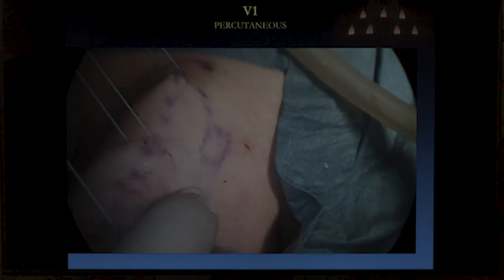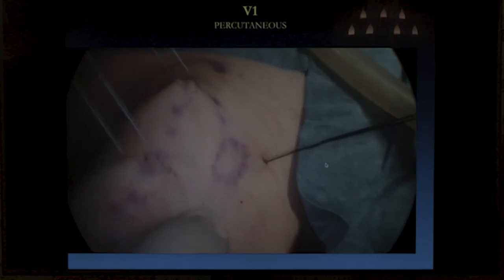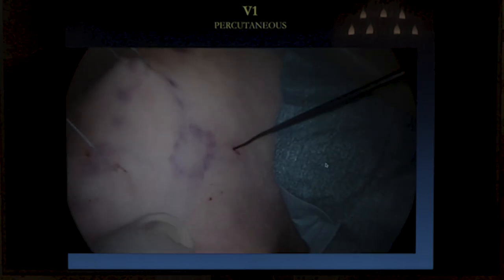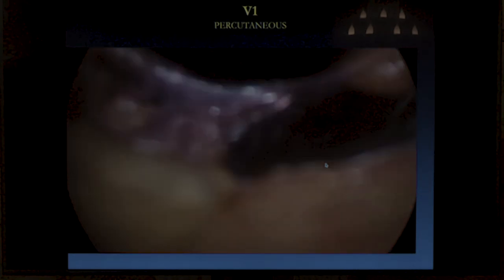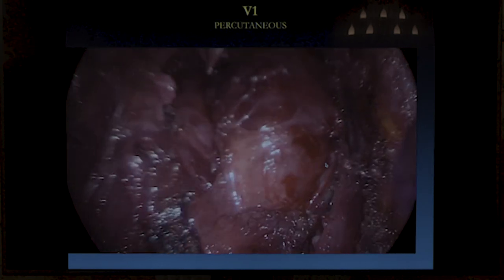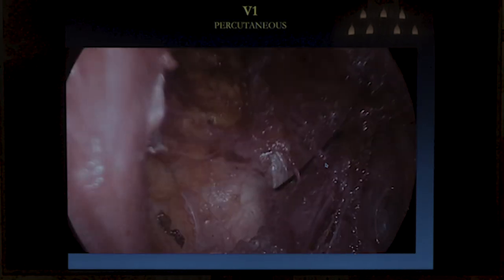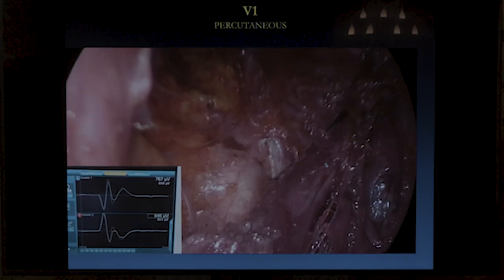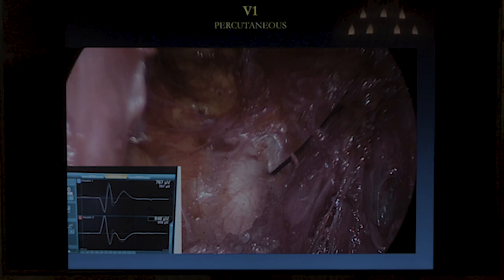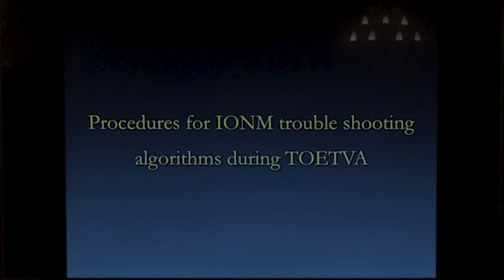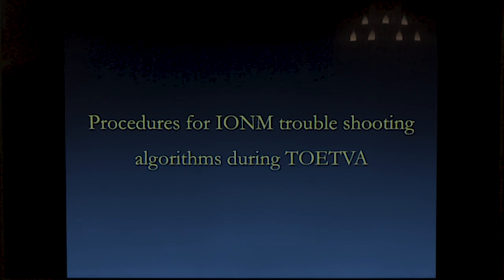This is the percutaneous way of stimulation. You make a small mark on the skin, insert the percutaneous probe, then go inside and insert the probe into the surgical field. This is probably the most common way to monitor now, because these probes are commonly available in your operating room and you don't need to request a long probe specially. This is a weak point of the transoral endoscopic thyroidectomy and monitoring association.